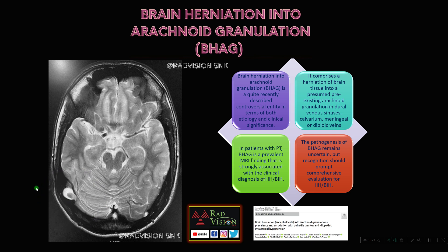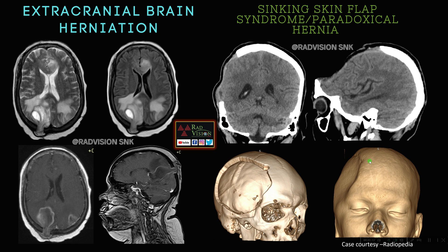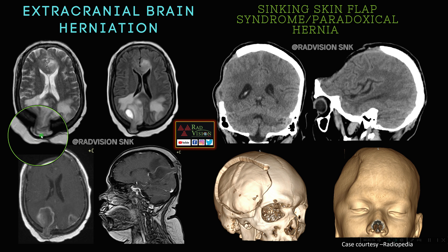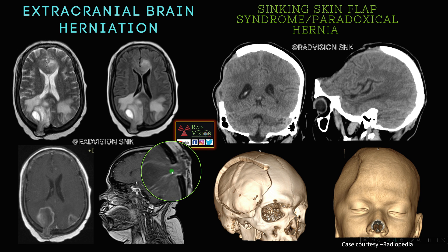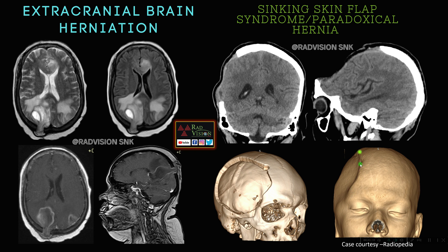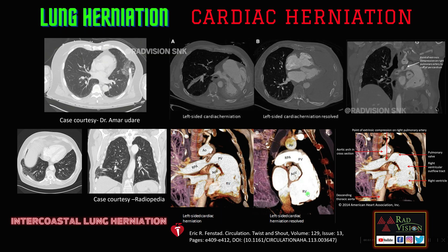Next we will see some atypical hernias. This is extracranial brain herniation — here you can see herniation of the brain tissue through a bony defect into the scalp tissues. This was a case of multifocal glioma. The other entity is when there is a craniotomy defect and there is invagination of the brain tissue through the craniotomy defect — this is called paradoxical hernia or sinking skin flap syndrome. So: this is outward displacement of the brain tissue, and this is inward displacement through the craniotomy defect.